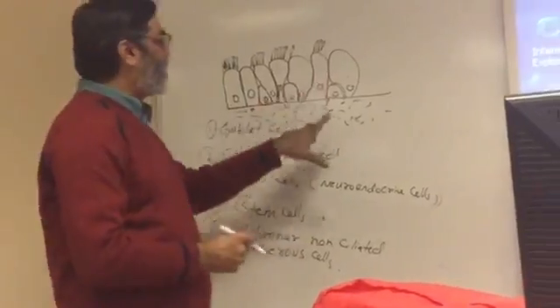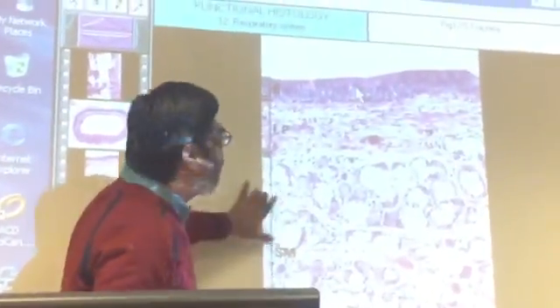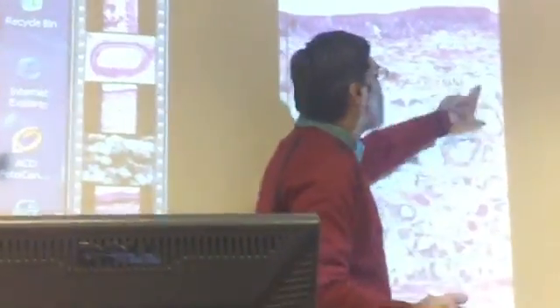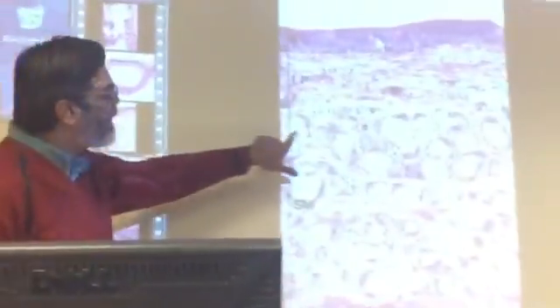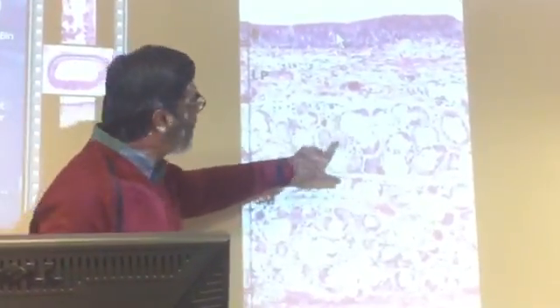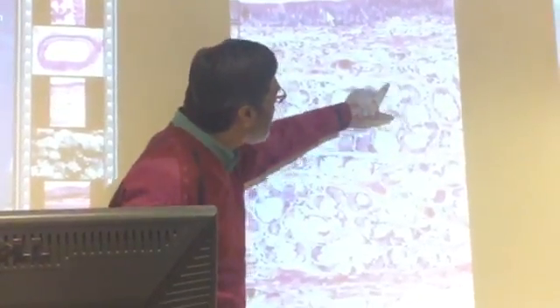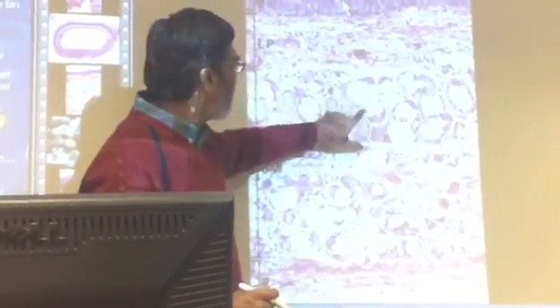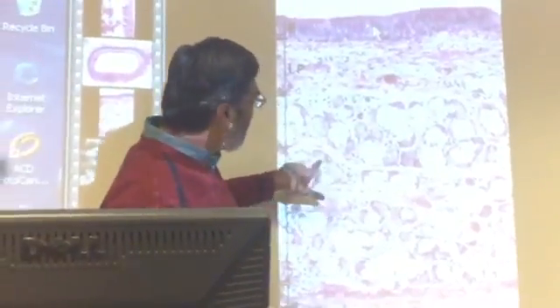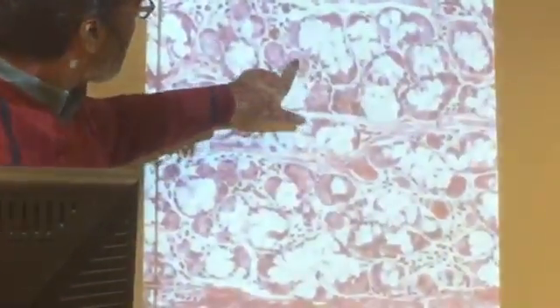And then we have submucosa. In the submucosa we have these glands. So these seromucous glands are present. You can see this is a gland, these are glands. Some of the glands are appearing whitish, they are appearing white. And some of them are dark. Here, this gland is a dark gland.